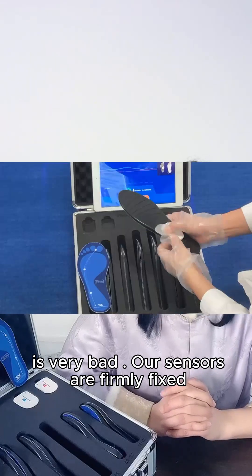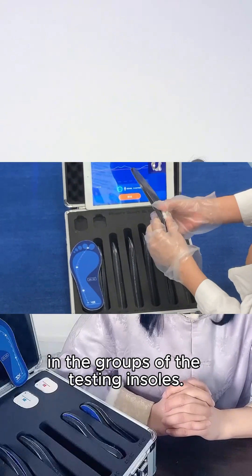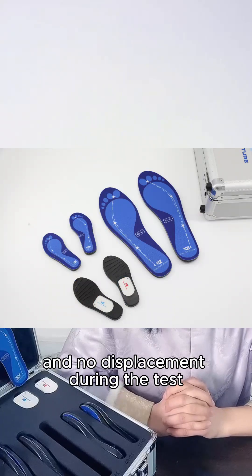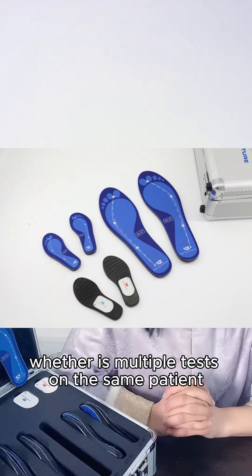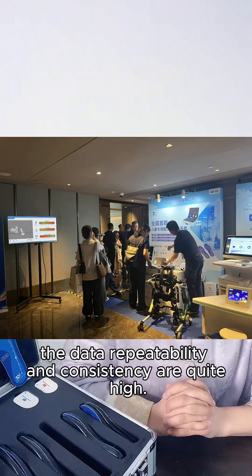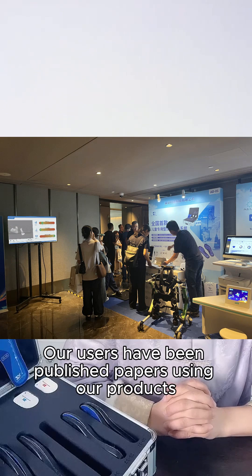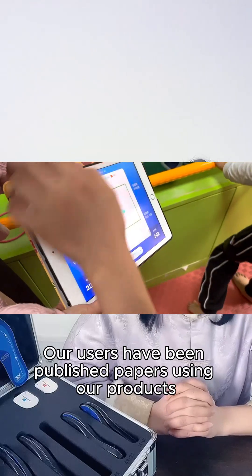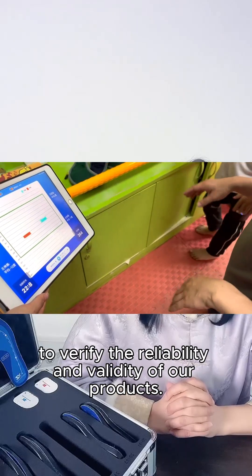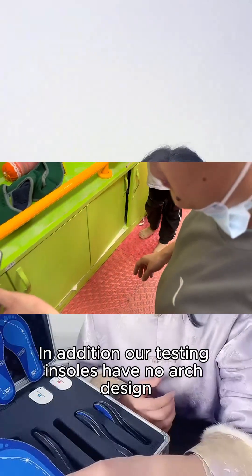Our sensors are firmly fixed in the grooves of the testing insoles, with the same initial position and no displacement during the test. Whether it's multiple tests on the same patient by the same therapist or by different therapists, the data repeatability and consistency are quite high. Our users have published papers using our products to verify the reliability and validity of our system.